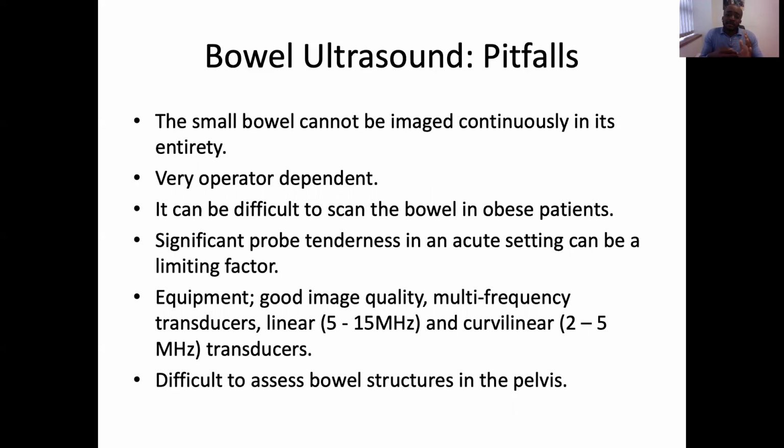And also, when patients have significant tenderness, it tends to be a bit of a limiting factor, because you might need to apply graded compression. And with a patient who is seriously in pain, that would most likely hinder you as a sonographer from doing so.